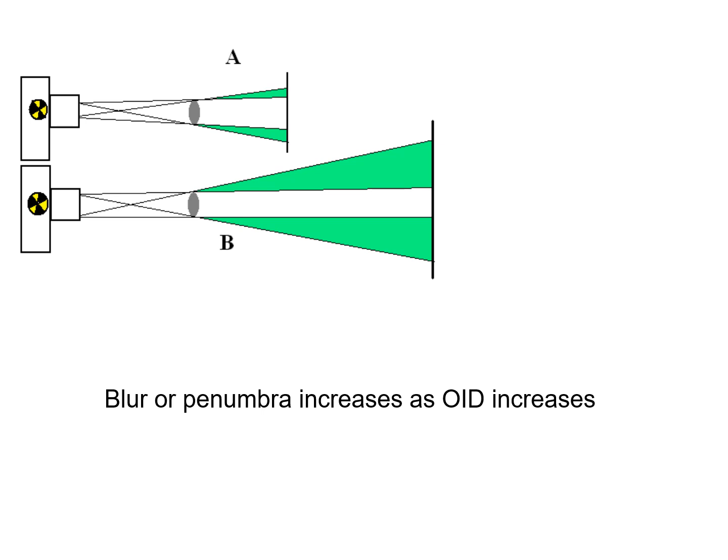And now if there's blur and penumbra, what's happening to the edge of that black line? Well, it's getting fuzzy. And so there's a real potential, especially with the new digital software. They have an algorithm called smoothing that evens out tiny discrepancies. It is very possible with incorrect positioning, that is, positioning the contusion or the area of interest away from the image receptor, and applying a smoothing algorithm, you can literally Photoshop off, just like the cartoon says, you had a rib fracture, but we fixed it with Photoshop. The blur and the penumbra and the smoothing algorithm can combine to completely erase a hairline fracture in modern radiography.